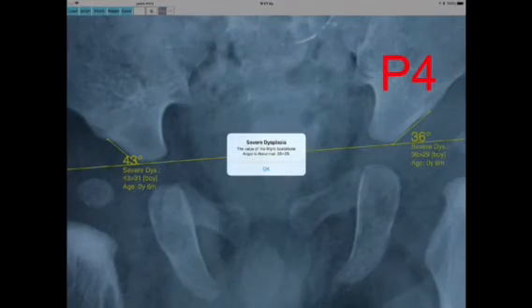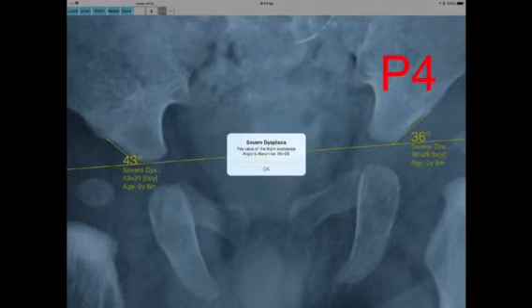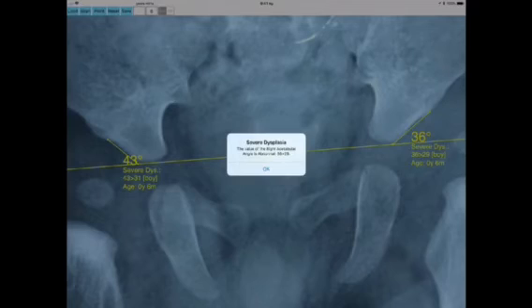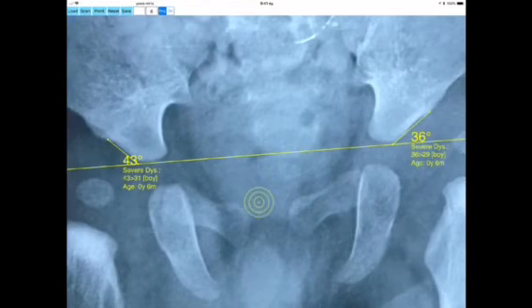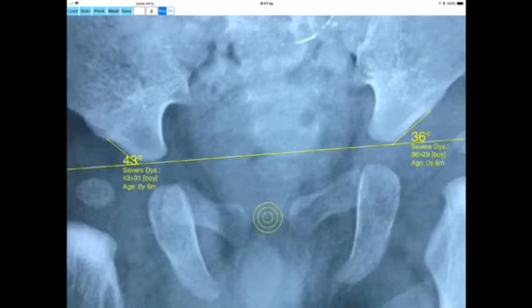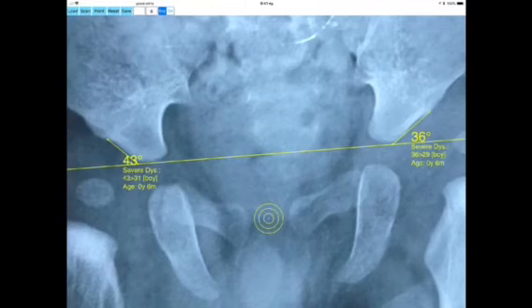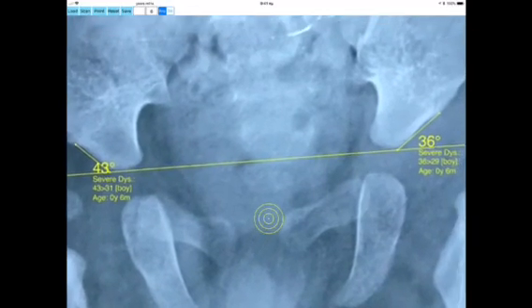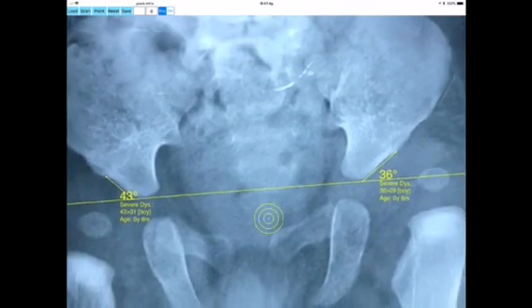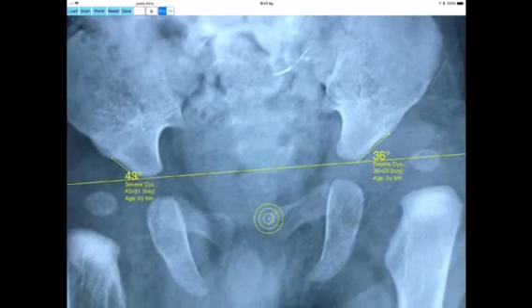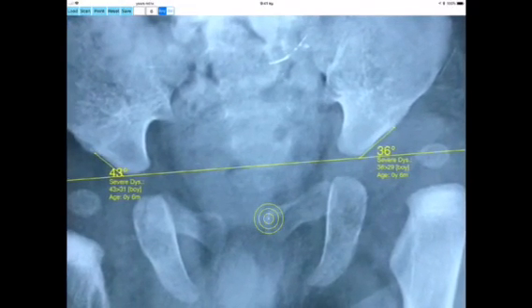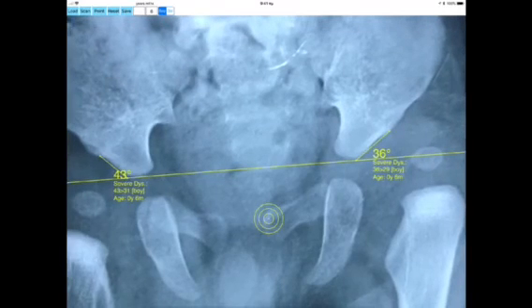In the app, the measured angle at a certain site — left or right — is automatically compared with values according to the normal reference database, TANIS. The results are printed on the screen and the hips are categorized as normal, light dysplastic, or severe dysplastic according to the measured AI angle. This feature is particularly useful in clinical settings where you need quick results without losing time looking for reference data by age in large textbooks.